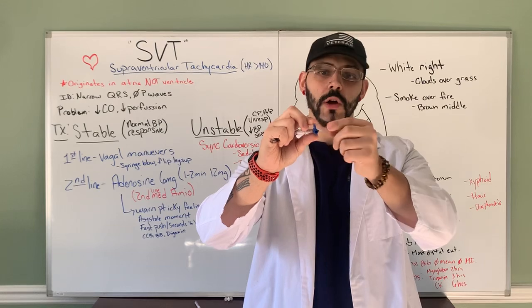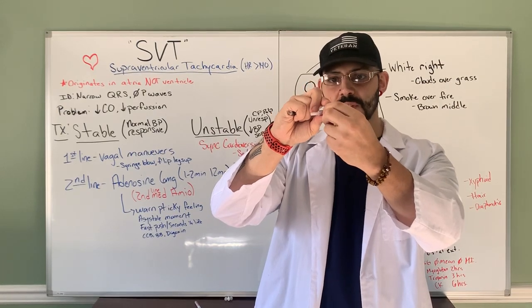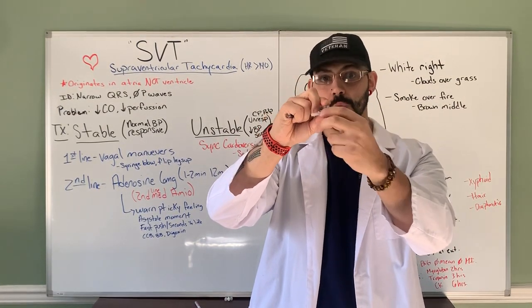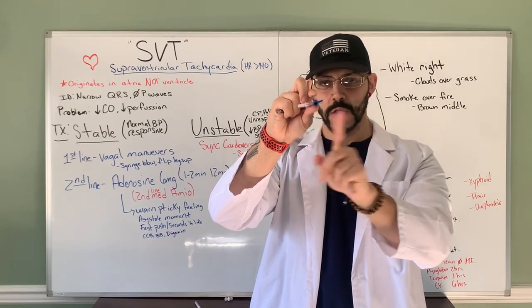So what we're gonna do here, let's talk about the lock mechanism here. This blue device has a locking mechanism. Wherever this blue mechanism is pointing to, that particular chamber is closed. So if you point it this way, it's closed off to the patient. This way, closed off to that chamber. This way, closed off to this chamber.